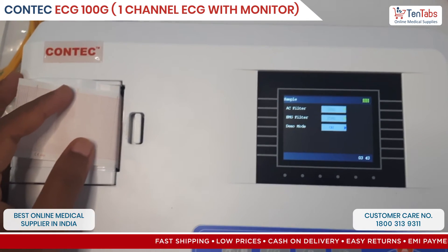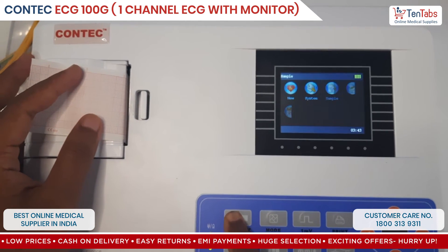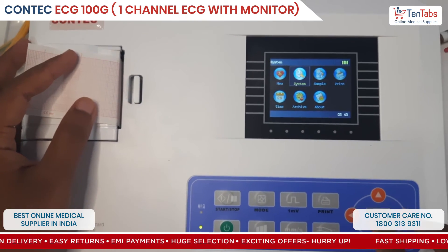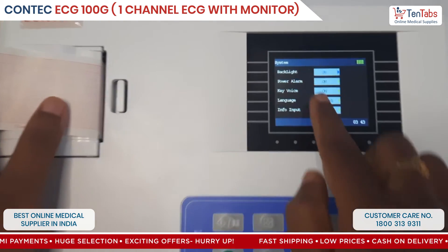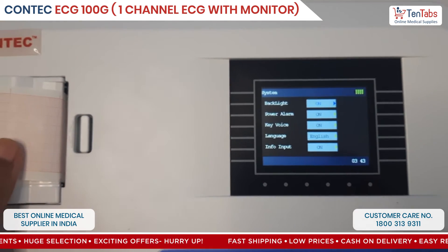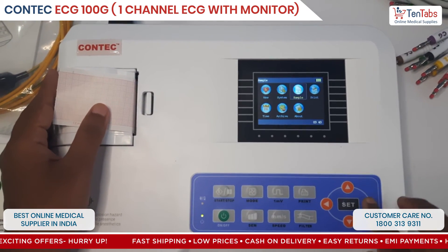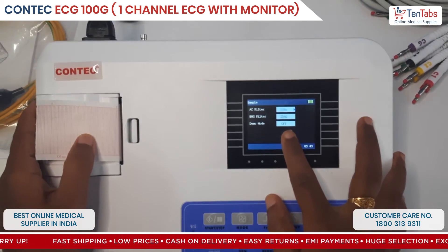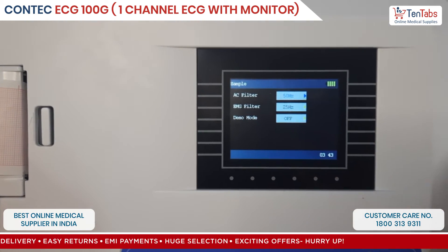You can turn off the demo mode, and go back. Here are some basic settings in the system like backlight, alarm, voice, and language — some basic information that you can set here. Here you also see the demo mode, AC filter, and EMG filter settings.